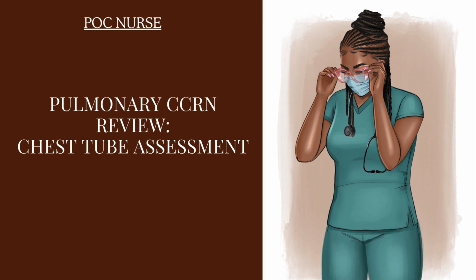Remember, we're studying all of this for the CCRN exam. So if you get questions like this about complications with your chest tube, once you do your intervention, you need to notify the provider, because the patient might need a follow-up chest x-ray, they might need a follow-up evaluation from the provider. Always notify the provider once you do your intervention after a complication. The next complication we may have is bleeding.